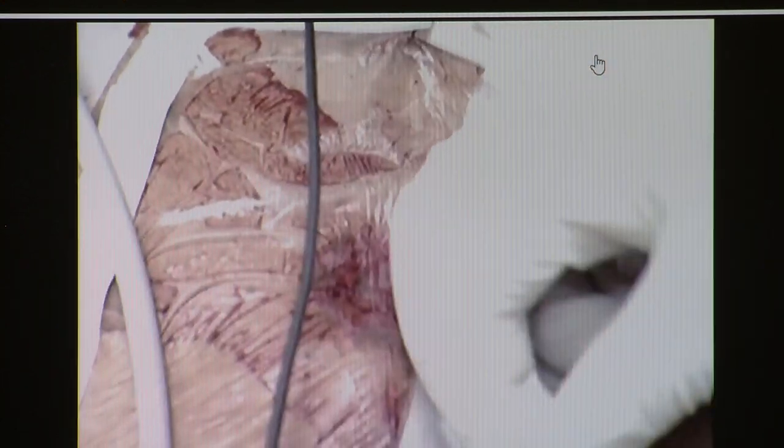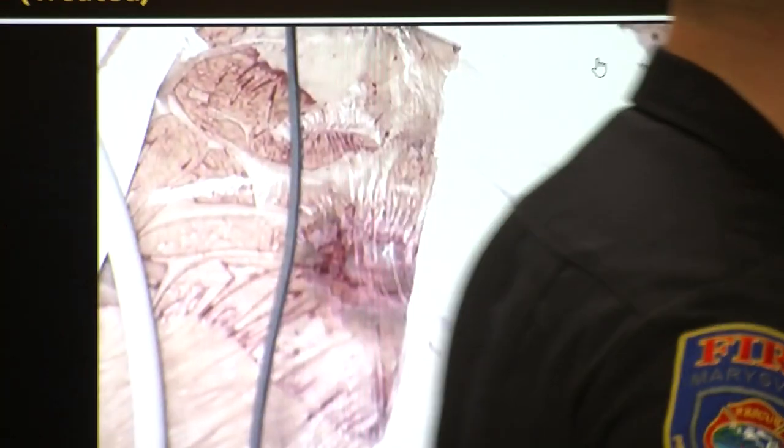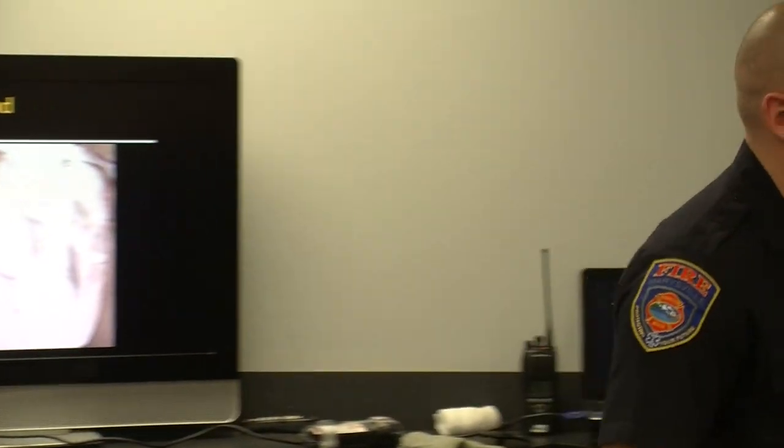That's what it looks like when it's treated. You can see it moving, still trying to pull in the air, but when it's sealed up, it prevents that. And it allows the lung to potentially start reinflating. You have to monitor these for a while, 20, 30 minutes or so from what I've been told.